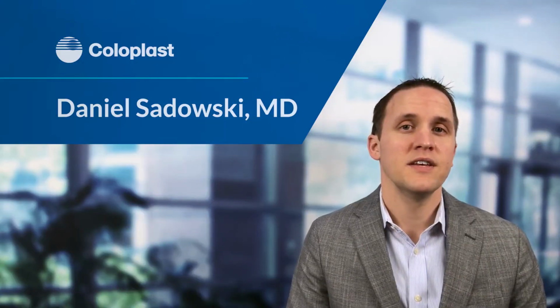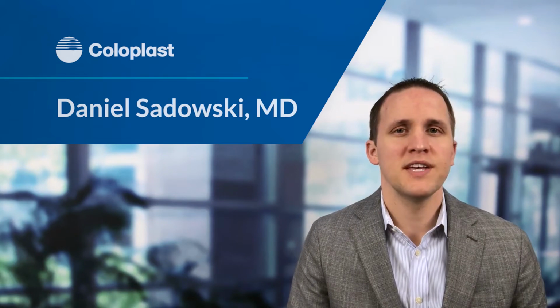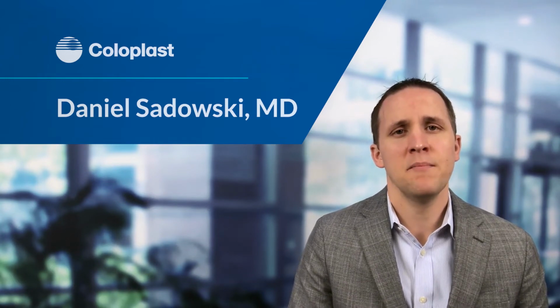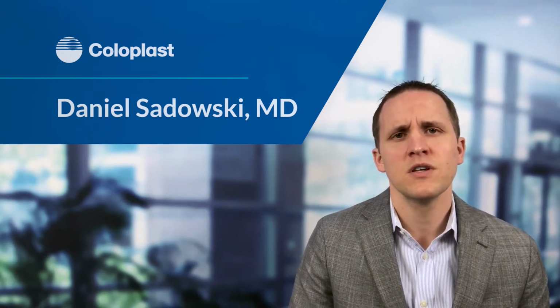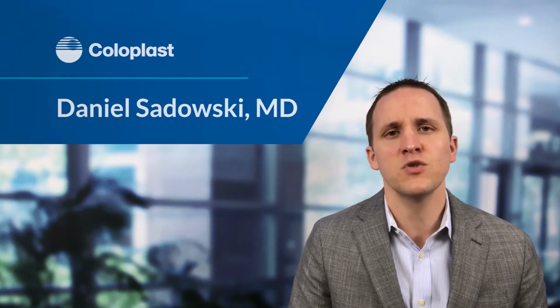The implant is easy to use. For the inflatable penile prosthesis, there is a pump that is placed in the scrotum, and that pump has two components. One, the larger bulb on the bottom is what you squeeze to inflate the device to create the erection, and then above it there's a smaller piece that you squeeze in order to deflate the device and return the penis to a soft state.